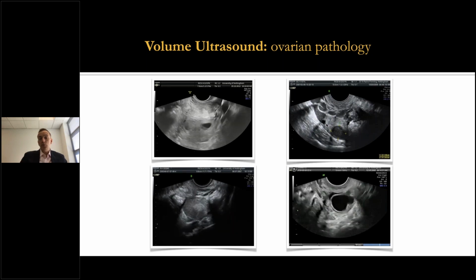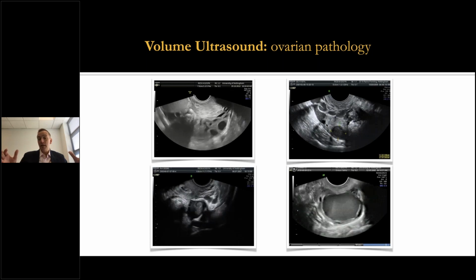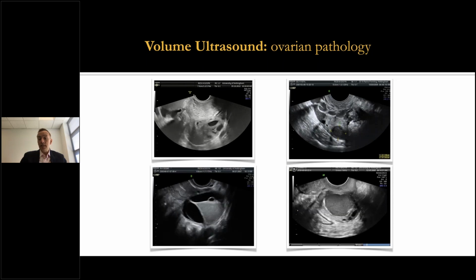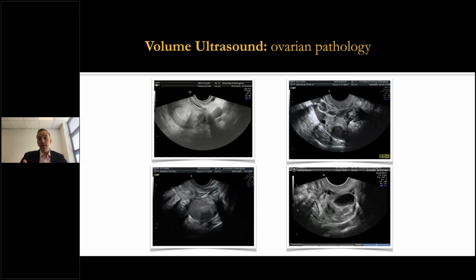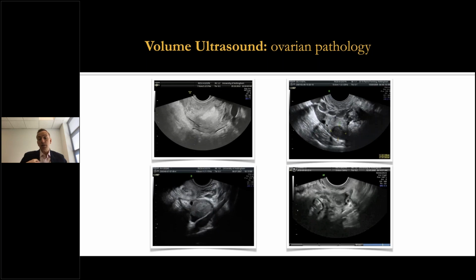It's more to do with, are they affected? Is there peritoneal endometriosis? And that's going to be the bigger issue. But we also have the same problem that if the needle goes into these at egg collection, then there's a much higher risk of infection. And that infection can actually be very severe and resistant to antibiotic therapy. So it's something we need to make our patients aware of.